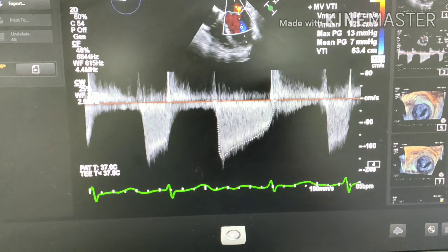Getting back to the mitral — this is a two-chamber view. You can see the classic diastolic hockey stick-shaped anterior mitral leaflet. It does not open totally, giving rise to the shape of a hockey stick in diastole, which is classical of rheumatic mitral stenosis. The posterior mitral leaflet is fixed, and the anterior mitral leaflet looks like a hockey stick in diastole, with the enlarged left atrium and spontaneous echo contrast.